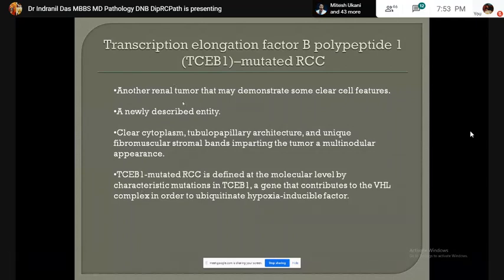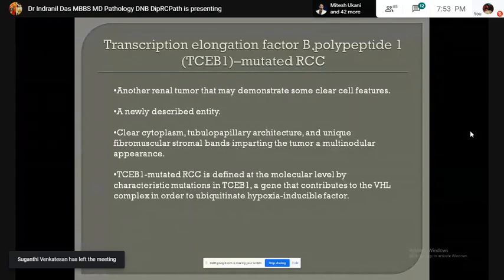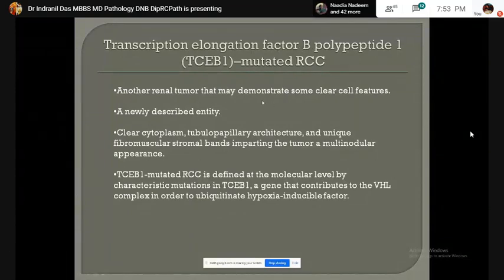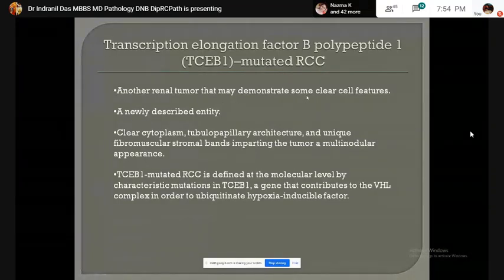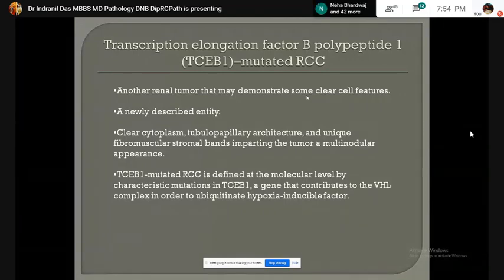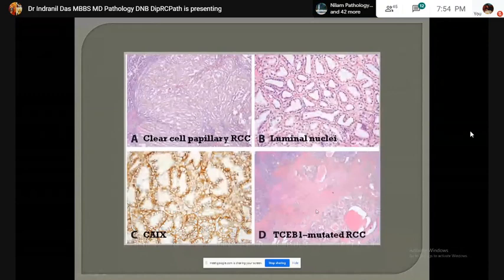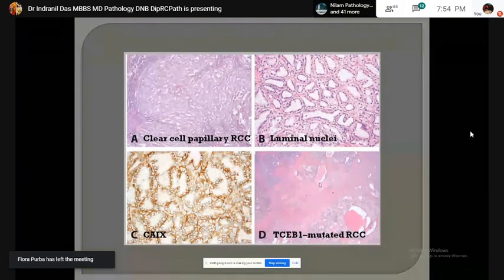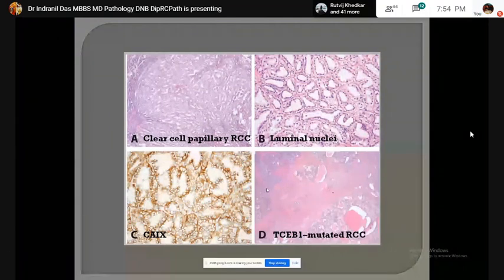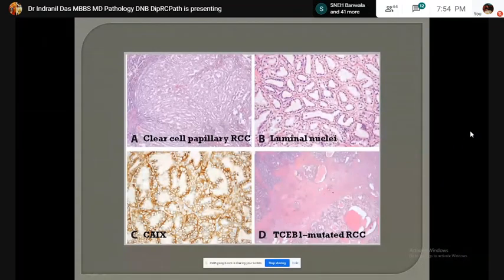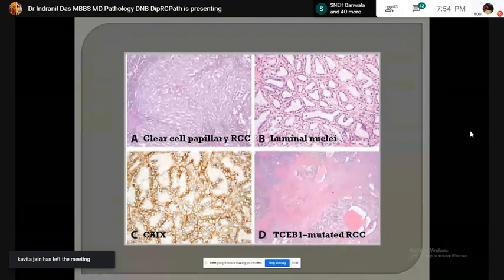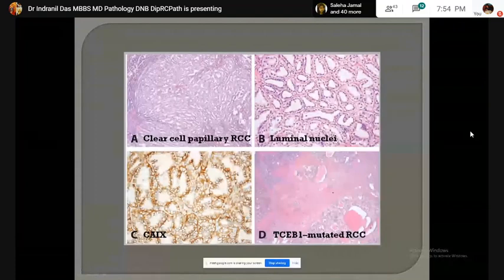The last entity in the clear cell subtype is TCEB1 (transcription elongation factor B polypeptide 1)-mutated RCC. It is another tumor with clear cell features and a newly described entity. TCEB1-mutated RCC shows a multilobular appearance due to the presence of stromal bands separating the tubular-papillary architectures containing clear cells. TCEB1 is a gene of the Von Hippel-Lindau complex, and carbonic anhydrase 9 is positive in a cup-like fashion with apically oriented nuclei.